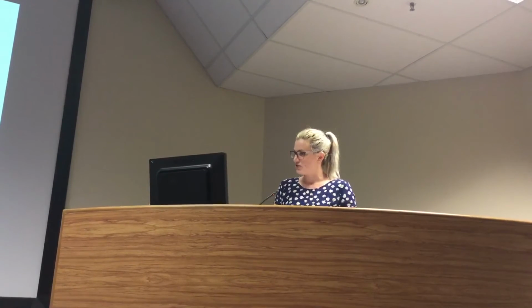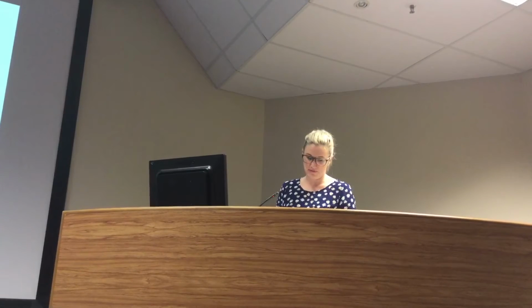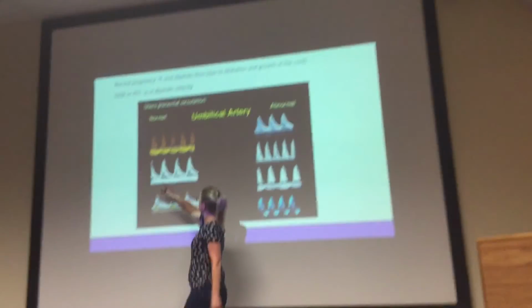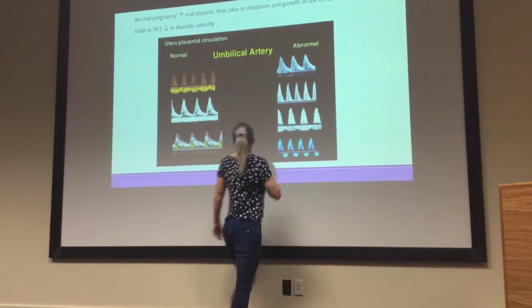So the umbilical artery PI. This is the first vessel that was ever to be evaluated by Dopplers. The flow velocity waveforms from the umbilical cord have a characteristic sawtooth pattern, with the arterial flow in one direction. The continuous umbilical venous blood sort of runs underneath, as you see here in this top one. This one here is the artery going this way, and this is the vein going that way.